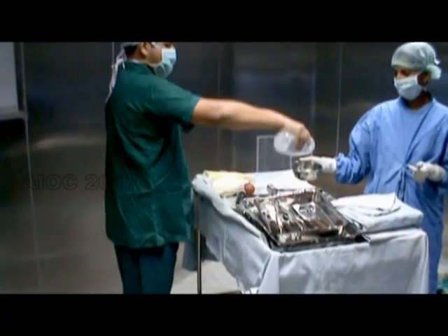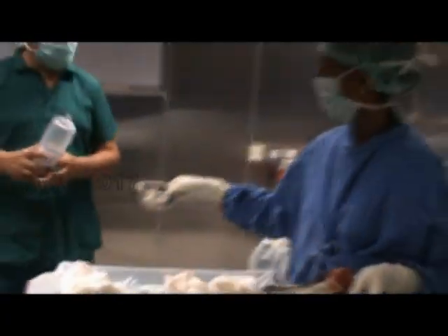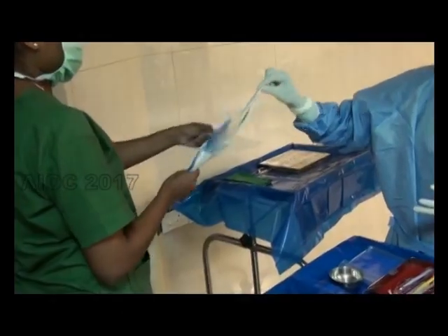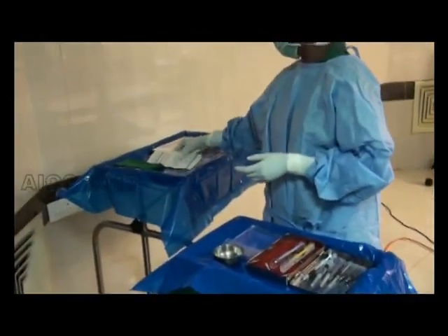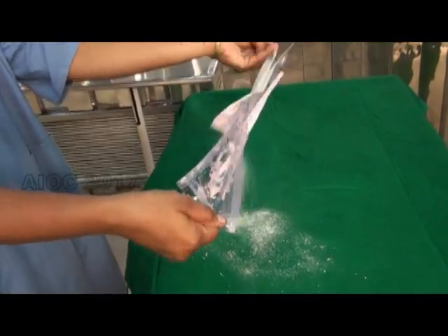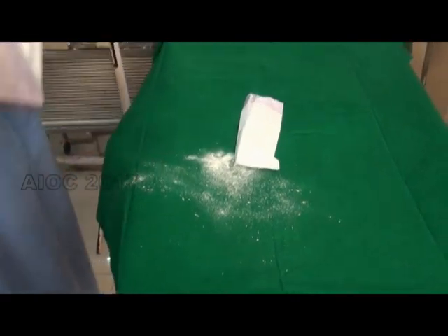Whenever a surgical item is introduced into the surgical field, it should not cross the field — it should be collected outside the field. To demonstrate the need for collecting outside, powder is placed on the pouch and the pouch is opened; you can see the powder dropping onto the surgical field.